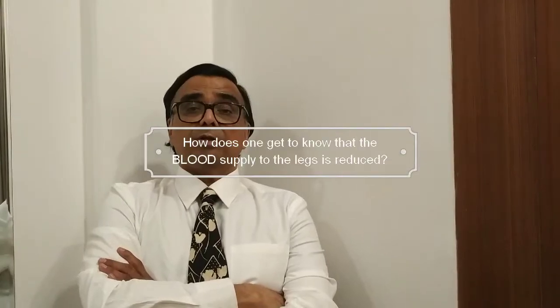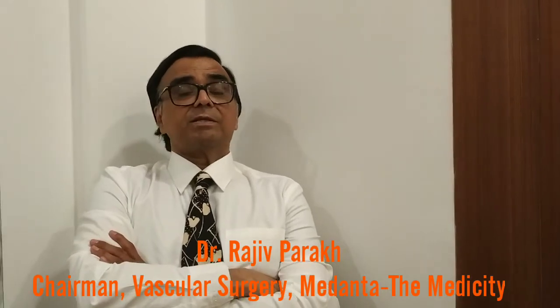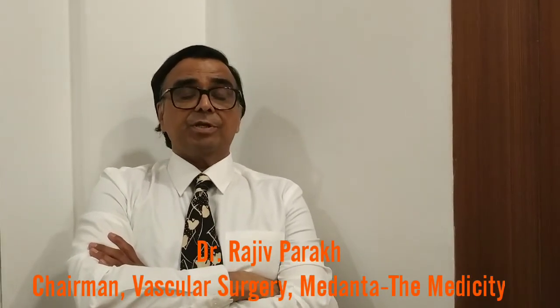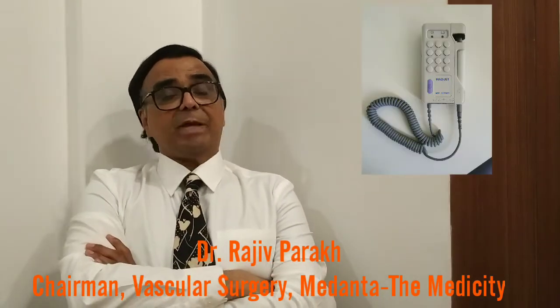About how does one get to know that the blood supply to the legs has gotten affected, has reduced, and that is the cause of the non-healing of the wounds. There is a simple pocket Doppler examination by which a small little gadget as small as that can actually pick up blood flow over any artery in the body, which is palpable under the skin, जिसको हम हाथ से check कर सकते हैं. So this machine actually gives us a fairly good idea as to whether the blood supply in that particular area is affected or not.